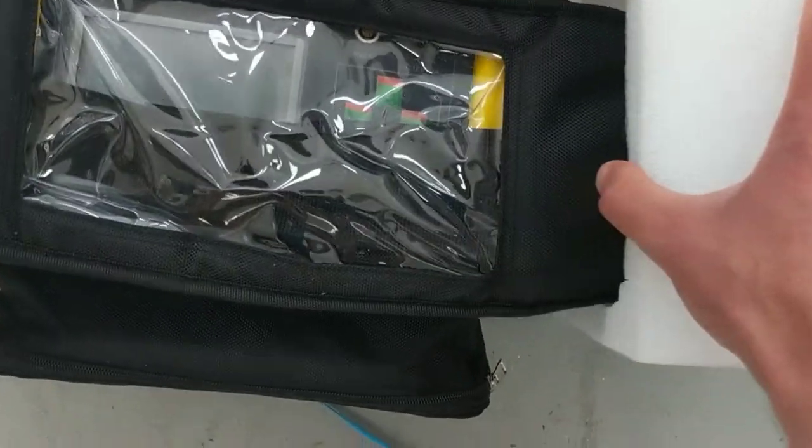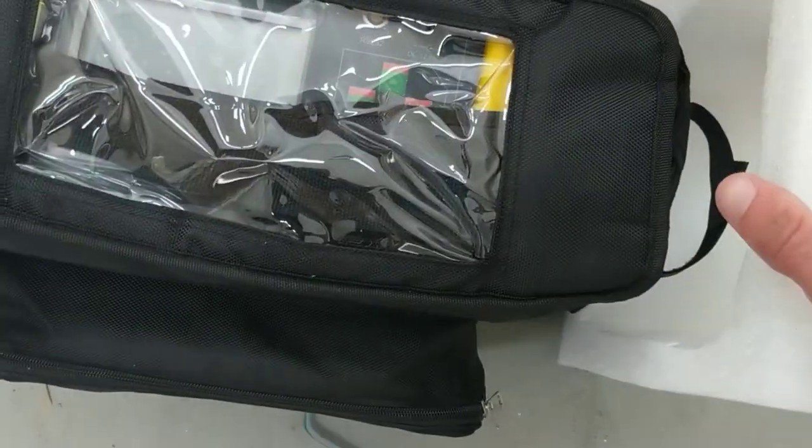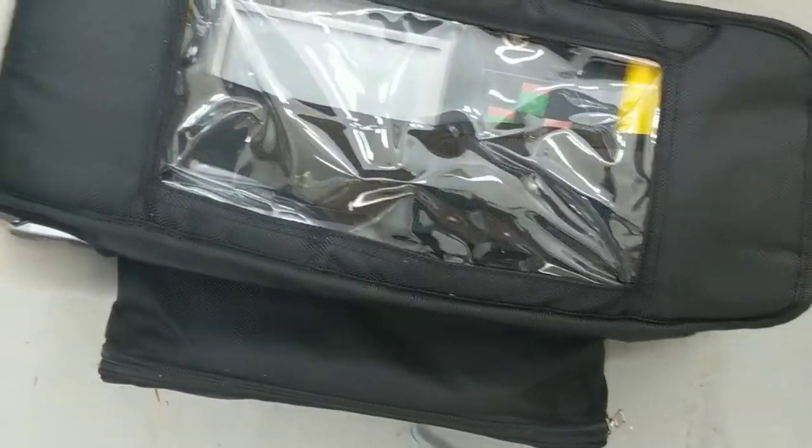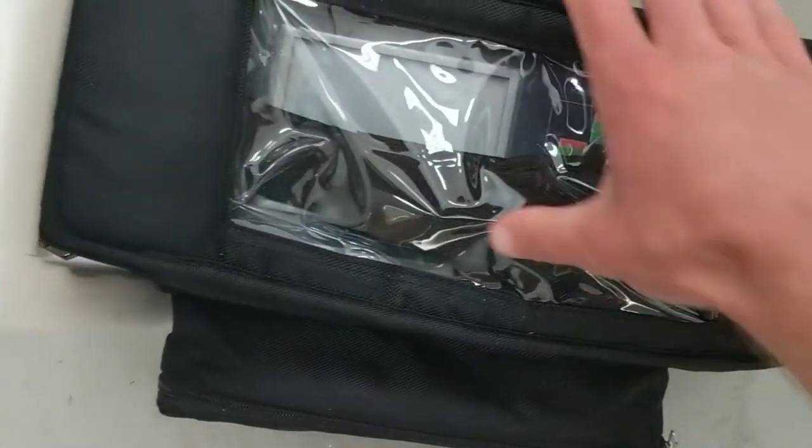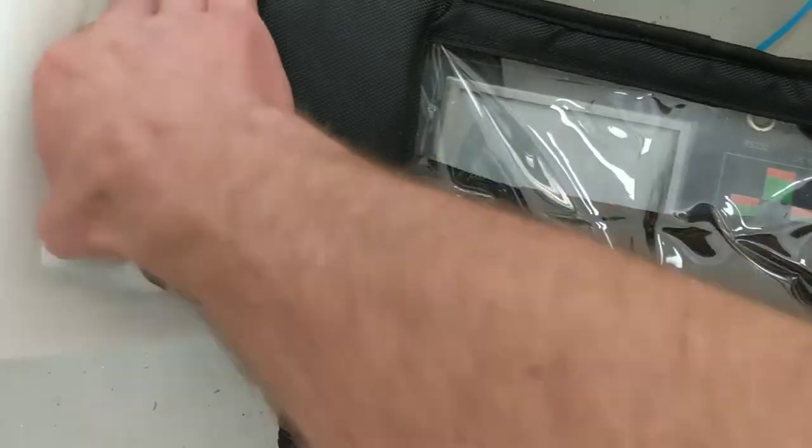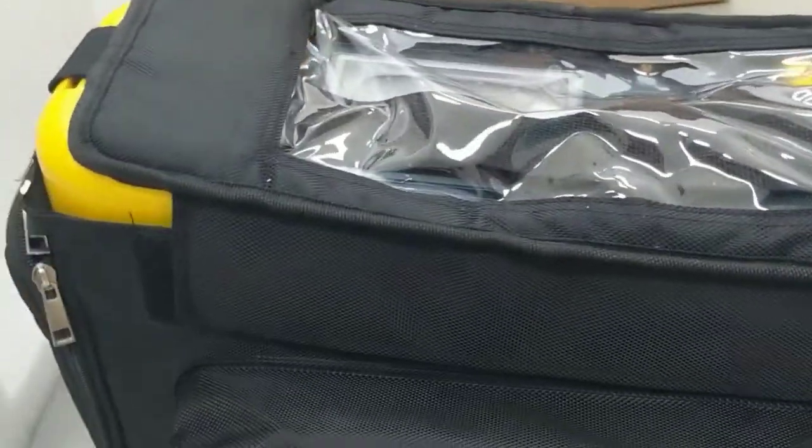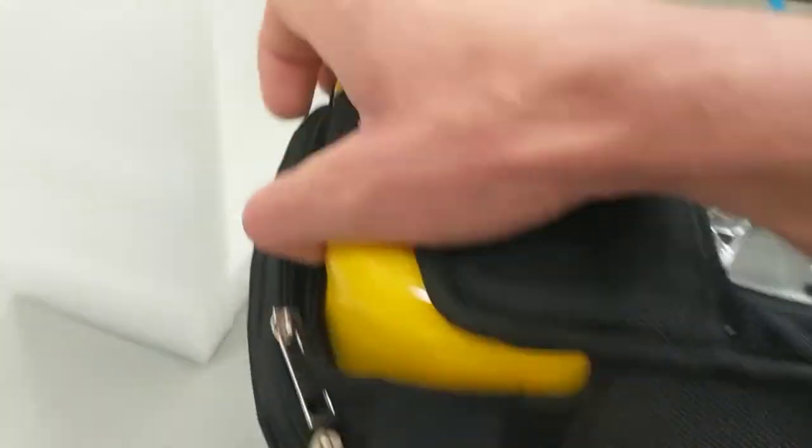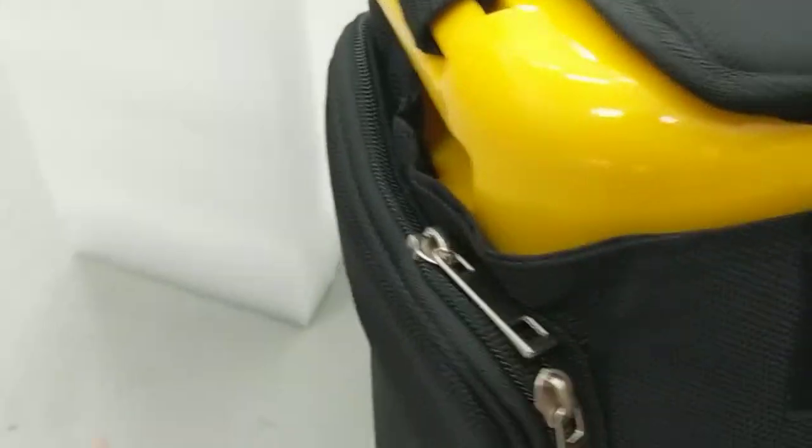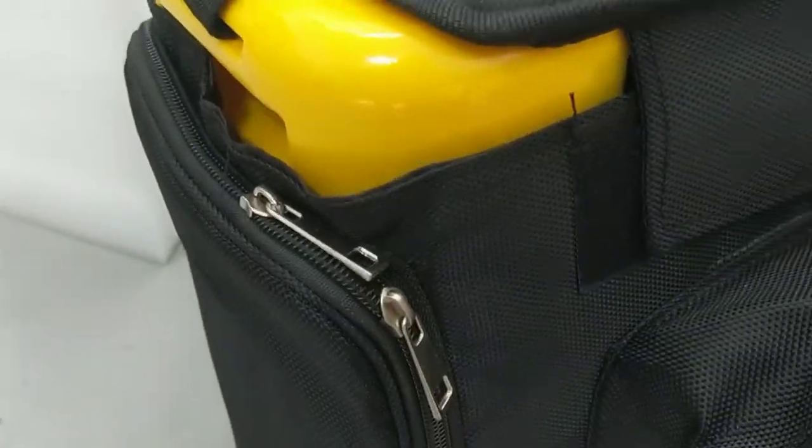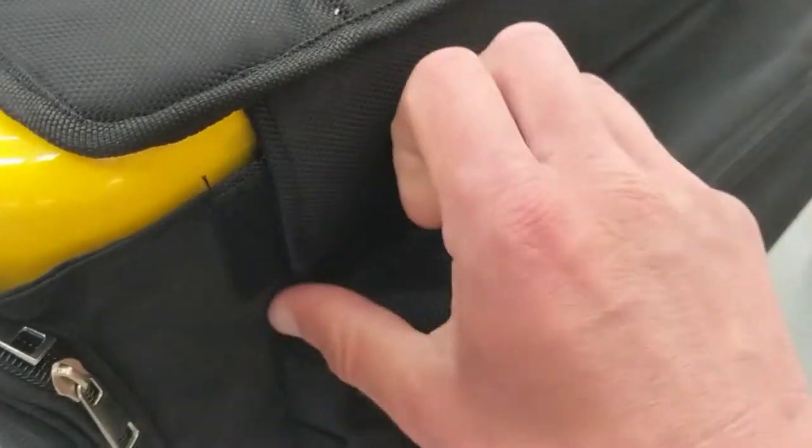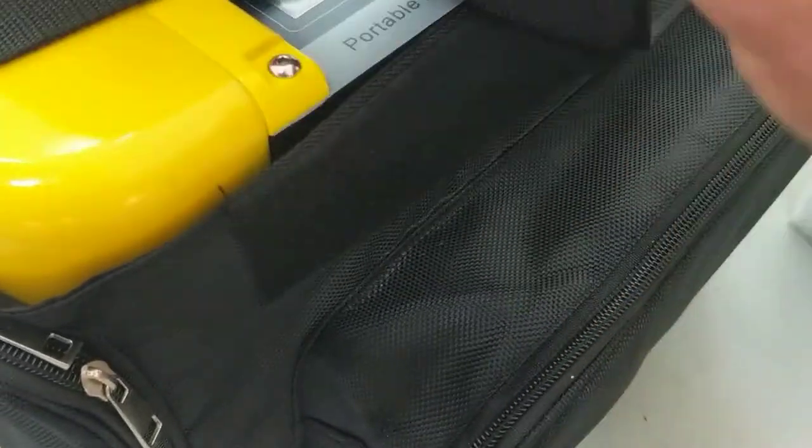Okay, this is the portable version which means it's got a fancy carrying case. Ooh, velcro.